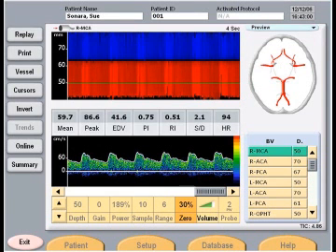Let's look at that same artery. This time, we're adding M mode. So M mode allows us to have an idea of where the artery is patent and other landmarks. In this situation, we see our cursor is in the M mode, which is this area above the waveform. Our cursor is at 50, and if you look down at our waveform information, our depth is shown at 50.